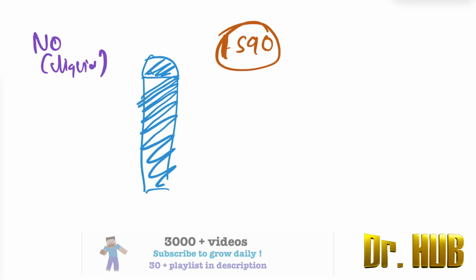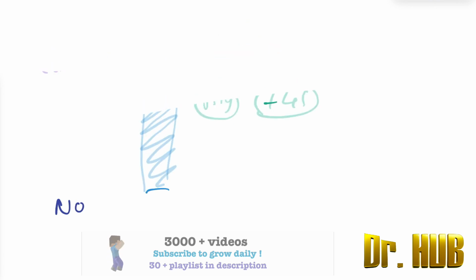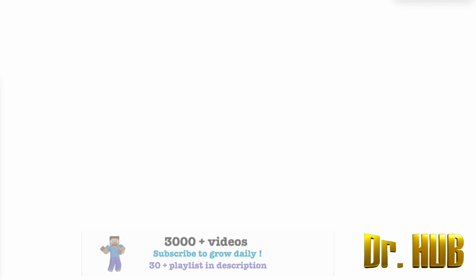So what is the pressure? Pressure is the PSIG. The pressure is 745 PSIG at 20 degrees Celsius. Next we will focus on the nitrous oxide. Let's erase this. Next we are going to look at the nitrous oxide.